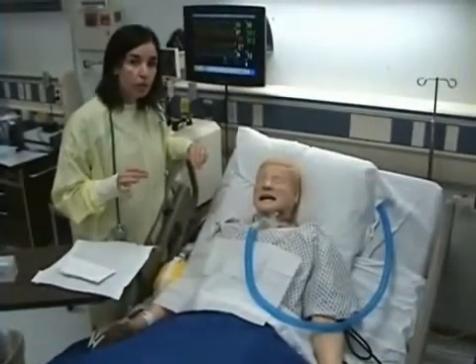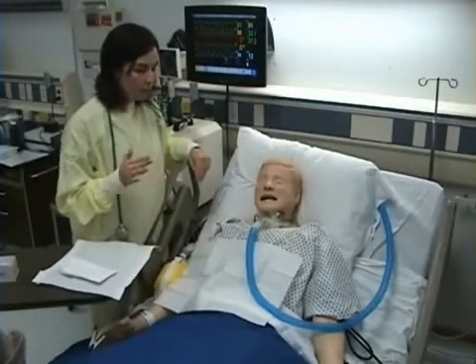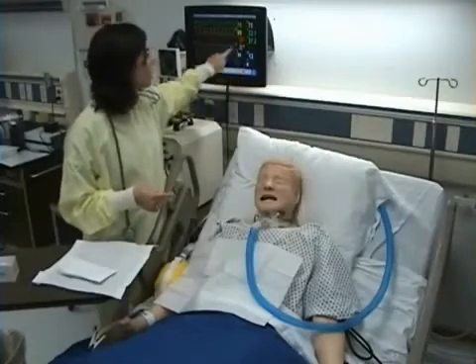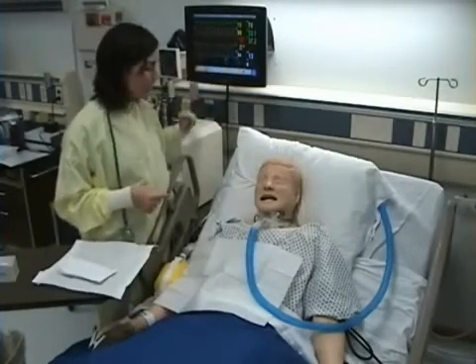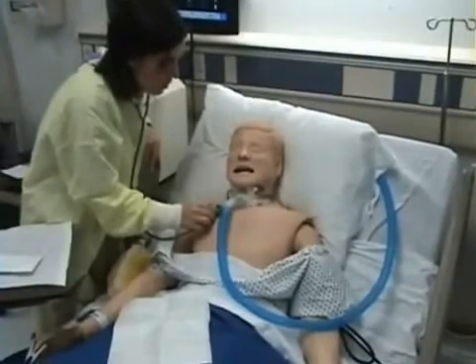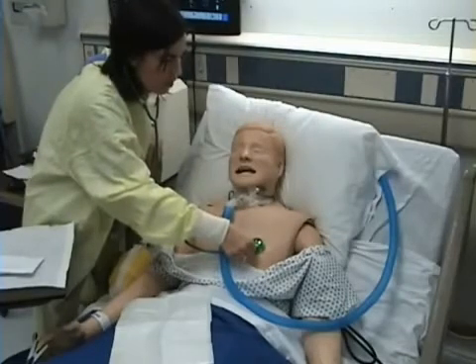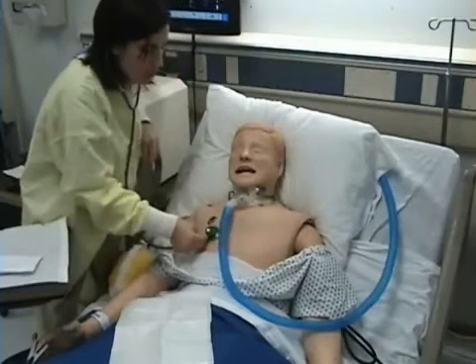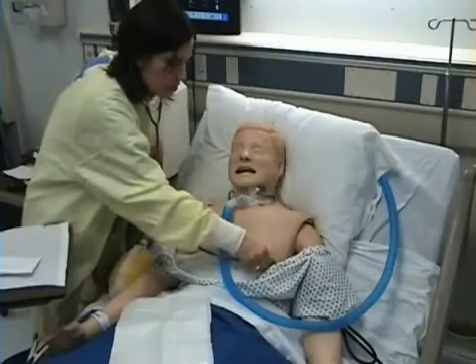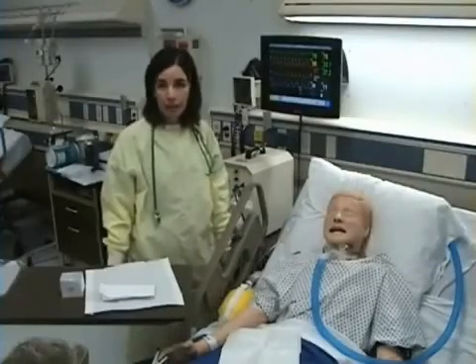It's necessary to do a full, complete respiratory assessment on my patient after I have suctioned my patient. I am going to check the respiratory rate again, either by counting it or checking the monitor. I want to note their pulse oximetry reading, which is 98, and I'm going to listen to their lungs. My final step will be removing my gown and washing my hands.